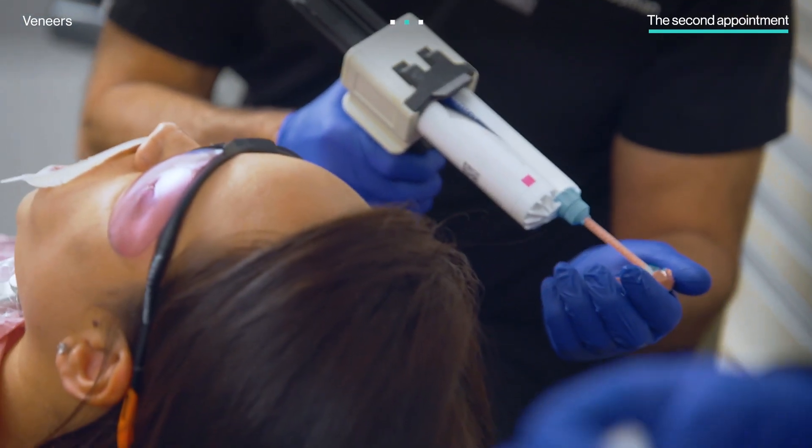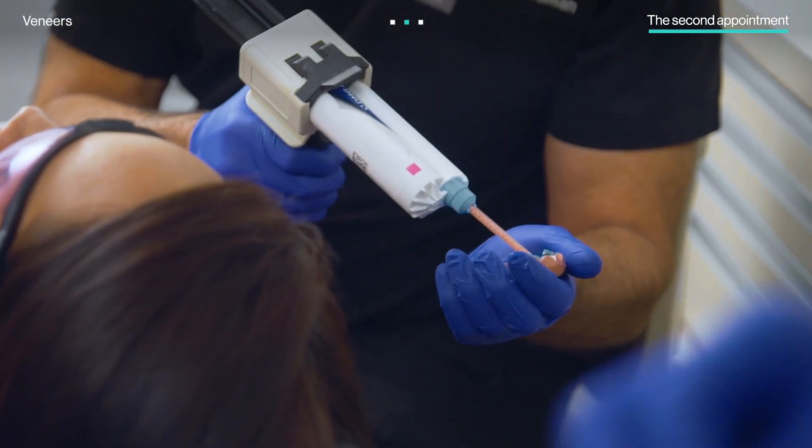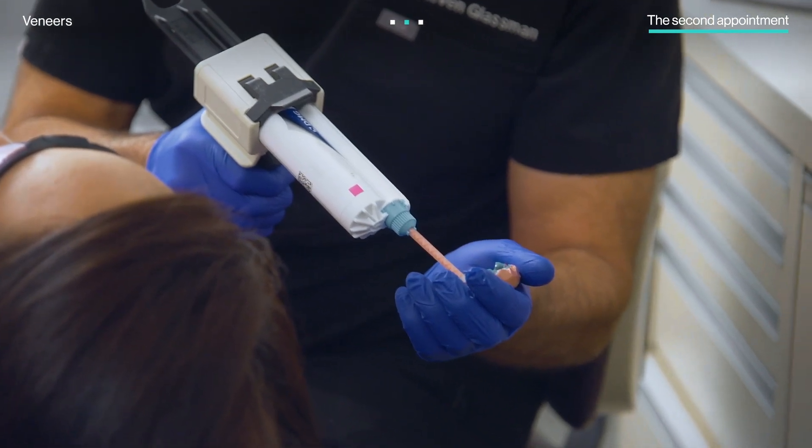Then Dr. Glassman used the lab's provisional template to create the provisional restoration.